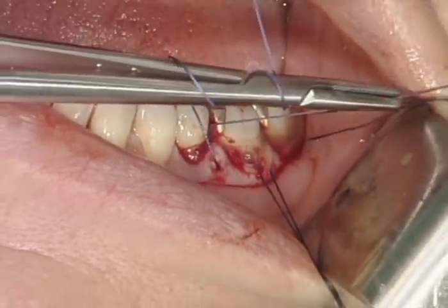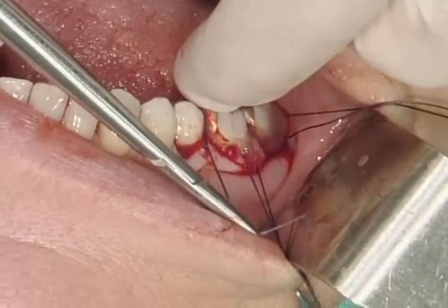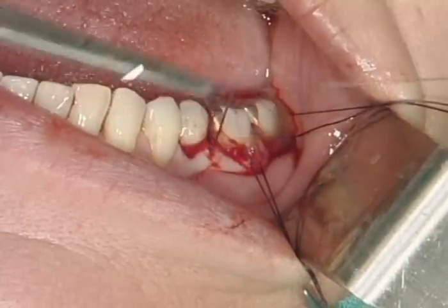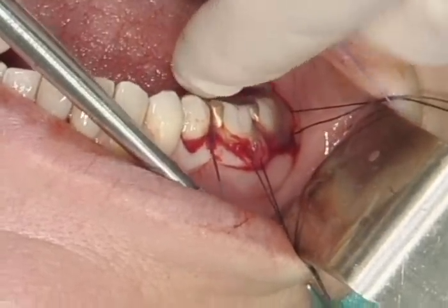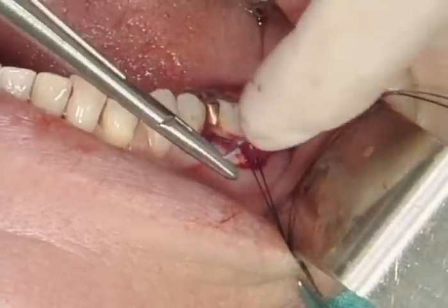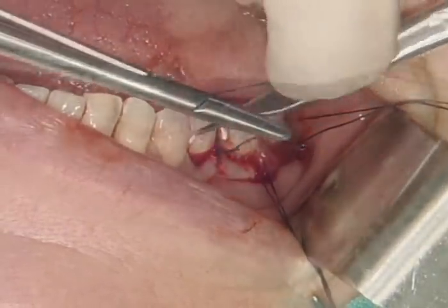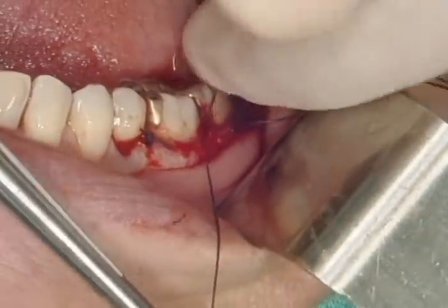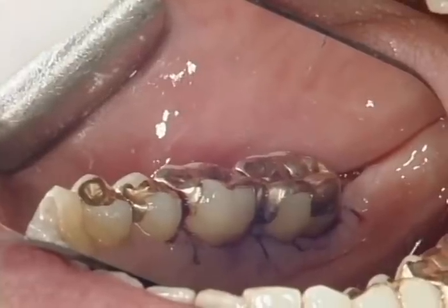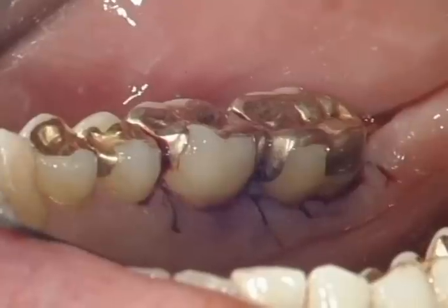The flap is finally closed using a tension-free technique. Here, the optimal adaptation of the soft tissue is essential. At this stage of the surgery, the assistance of a well-trained nurse is very helpful. The final view shows a well-adapted, tension-free gingival margin.